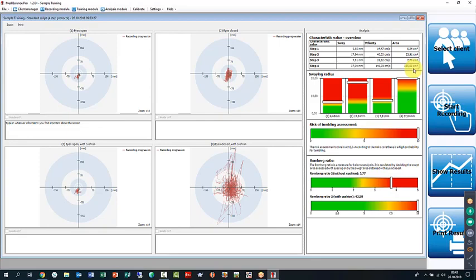Usually 3 digits already here is very high. For the most part, you'll see something like 1, 2, 5, 50 if somebody is already pathological. 50, 60, 70, 80. So it's like a huge step. Perfect standing in the first 3, and then a really high difference, like 10 times the original value in the final measurement. So it doesn't have to be above 100, but if it is above 100, that's an indication for something very unusual. And then we need to see why this is.